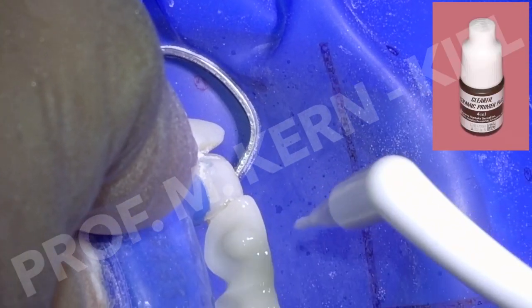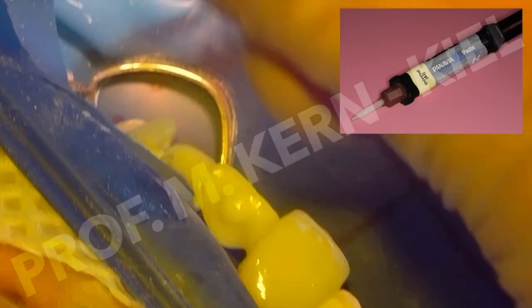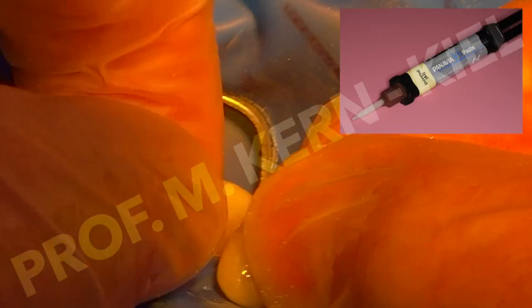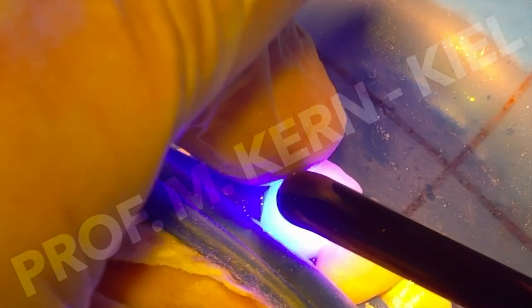A phosphate monomer-containing primer was applied, and the pontics were bonded using a dual-polymerizing luting resin. After removing excess luting resin, it was light-cured. The veneer was then inserted in a conventional manner.